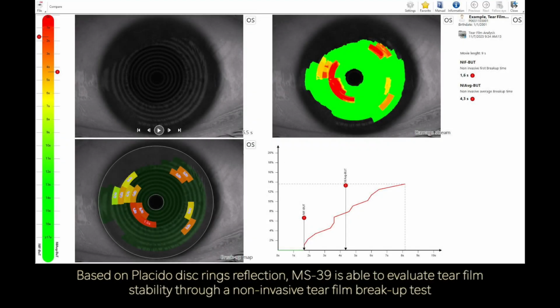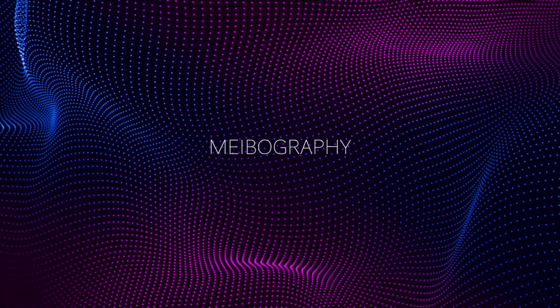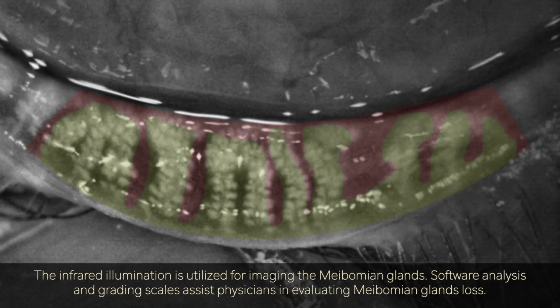Based on Placido disc rings reflection, MS-39 is able to evaluate tear film stability through a non-invasive tear film breakup test. The infrared illumination is utilized for imaging the meibomian glands. Software analysis and grading scales assist physicians in evaluating meibomian gland loss.